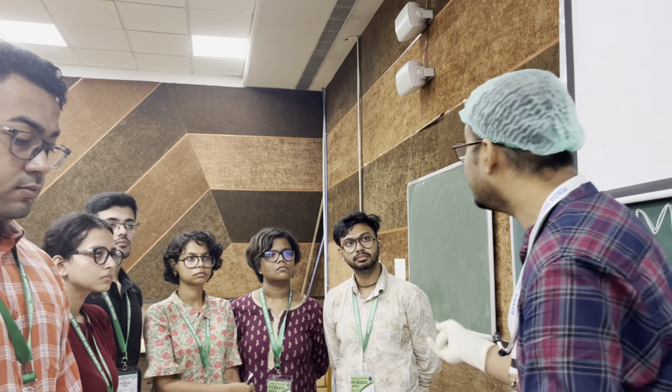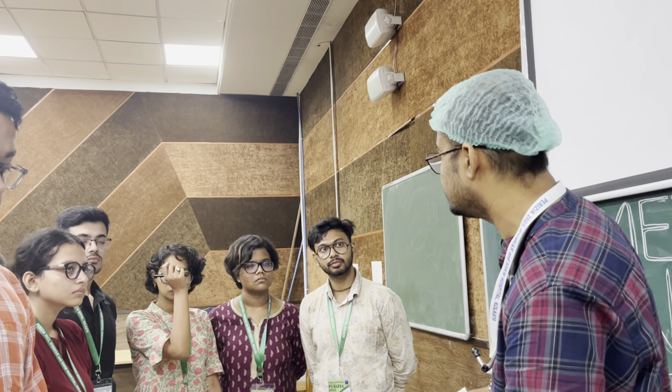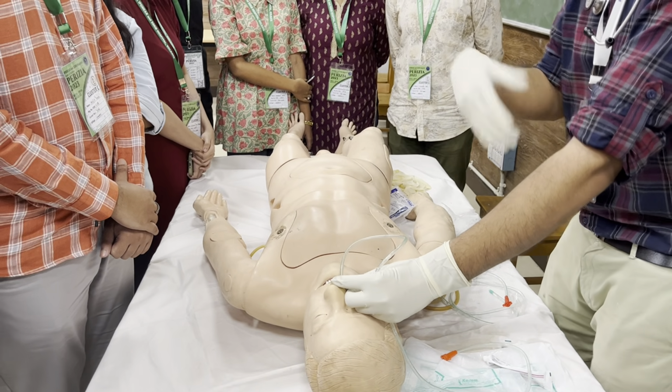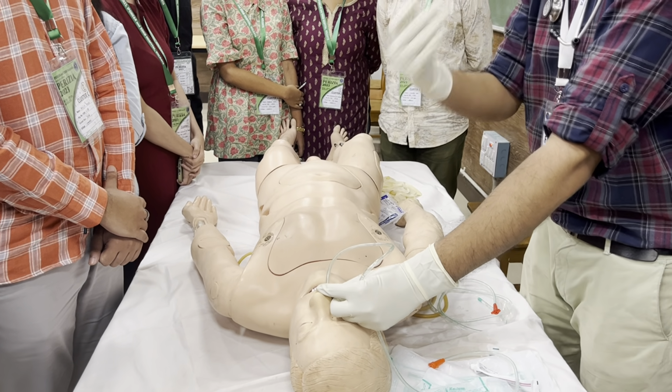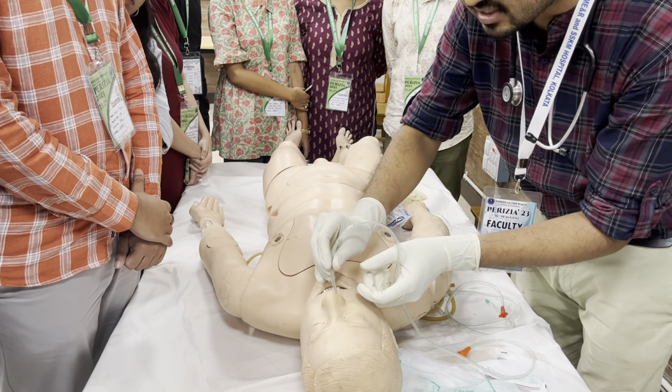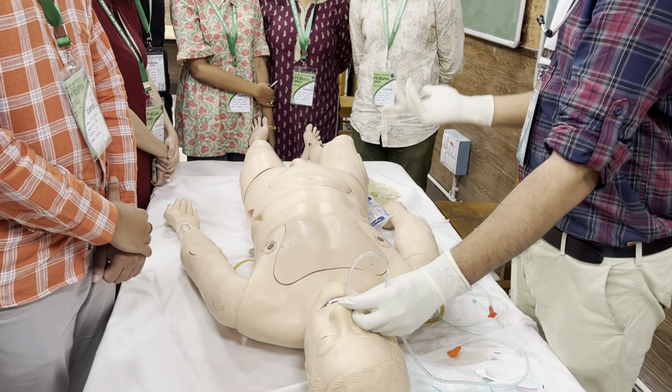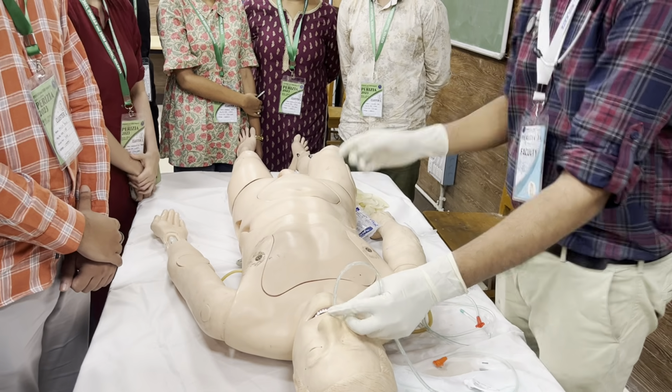It will not enter into the larynx, it will enter into the food passage, into the esophagus. So as the patient is gagging, I will ask the patient to swallow. The patient will swallow. If the patient is unconscious, there is no need to tell, because he or she will not swallow.